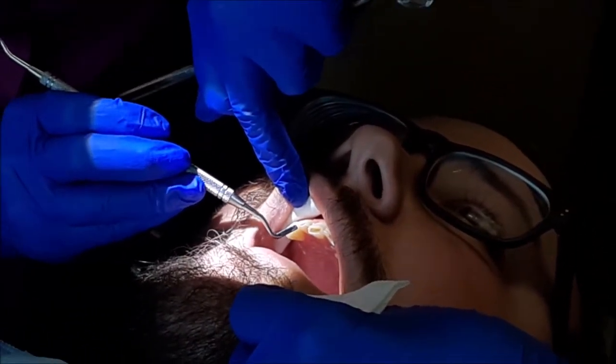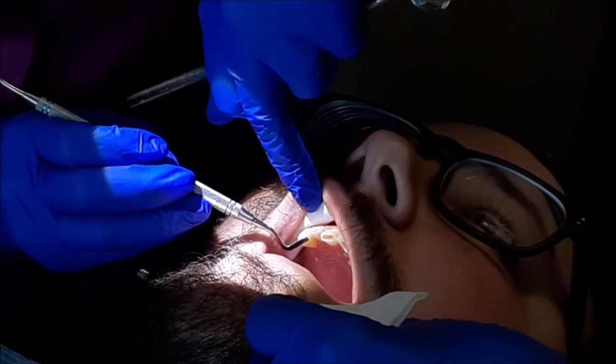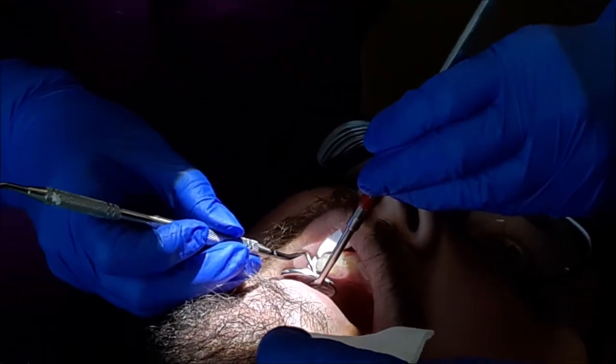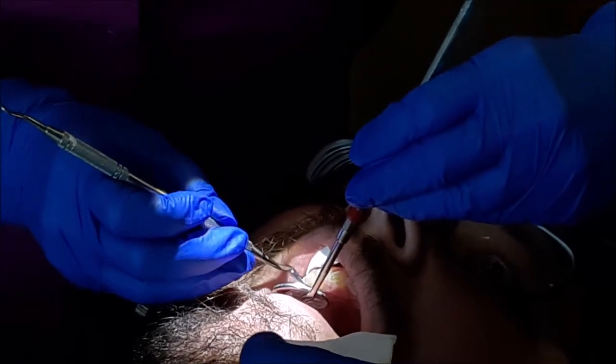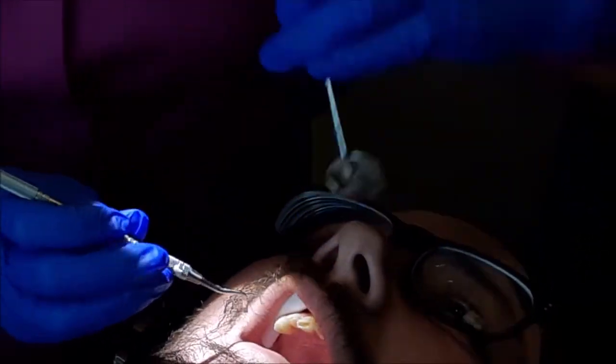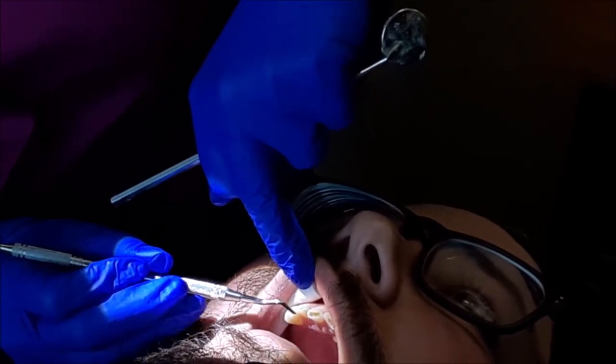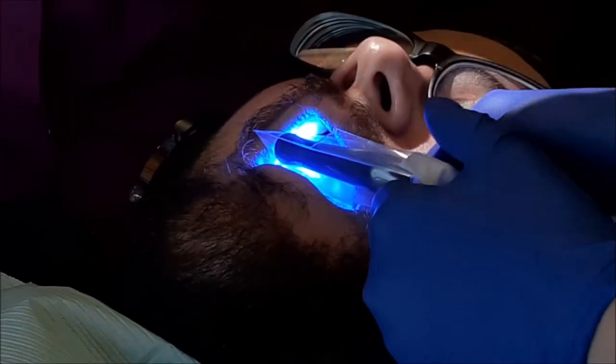Is it just like building it back up or just filling the hole? A little bit of both. I can't fill it up too much or else it'll change his bite. Right. It just hopefully it doesn't get worse in there, huh? Yeah, I'm basically trying to get it so that when he chews, he's kind of wearing down the composite rather than his tooth. So right. It's kind of doing a second barrier.